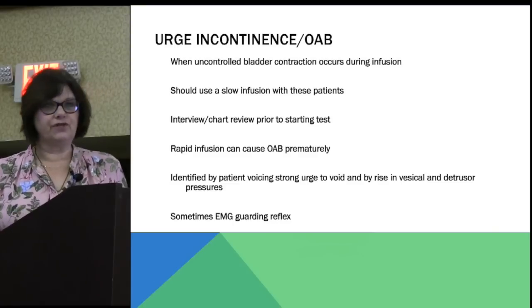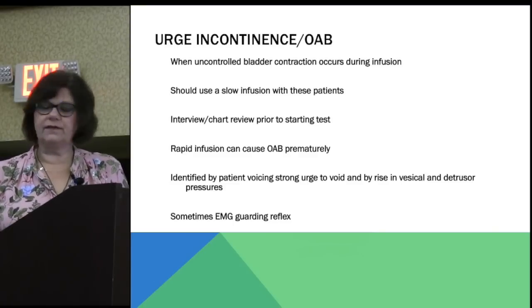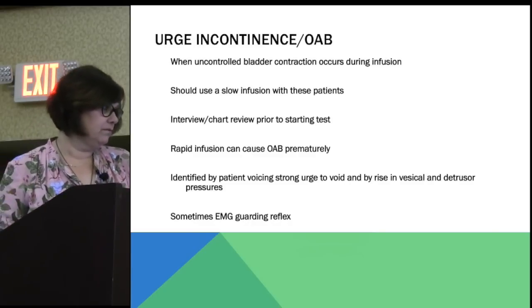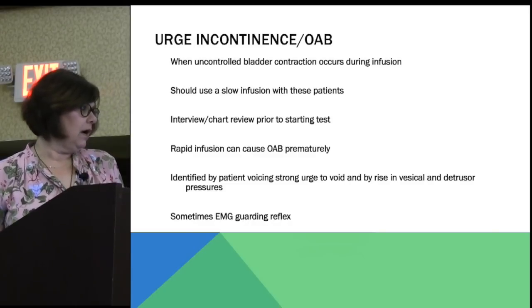So again, you want to do a chart review or talk to your patient before you start the test, to know how to deal with these patients with complaints of urge incontinence.